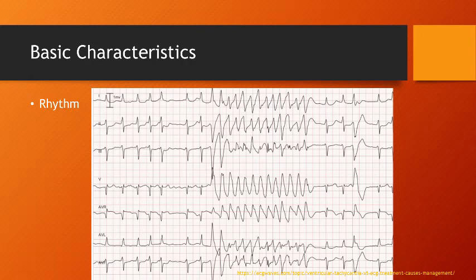When the onset of arrhythmia is available for analysis, a period of some irregularity and acceleration suggests VT. This phenomenon is called the warm-up phenomenon. Like you can see in this picture, there is some irregularity before the initiation of the rhythm, and hence it can give us an idea that the rhythm is a VT rhythm. However, more marked irregularities of R interval also occur in polymorphic VT and atrial fibrillation with aberrant conduction.